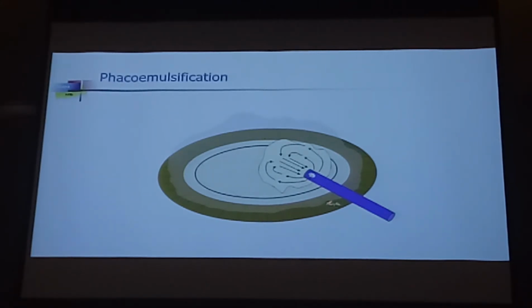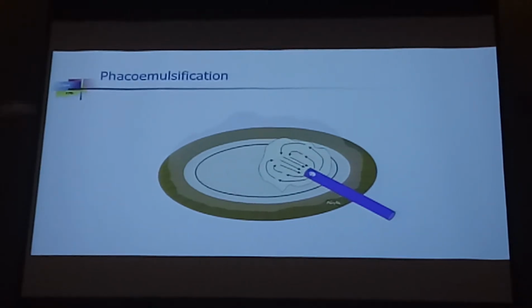Some will require you to remove more. Some, if you are able to keep it in small pieces, small local space, you're okay. At this point, that is why some people prefer to use two viscoelastics, dispersive to coat the endothelium, because they break into pieces, they stay at the endothelial level. But for Phaco, the main center core, you want to use a cohesive because you remove that, you create an aqueous, local flow channel, you can do your Phaco more efficiently.